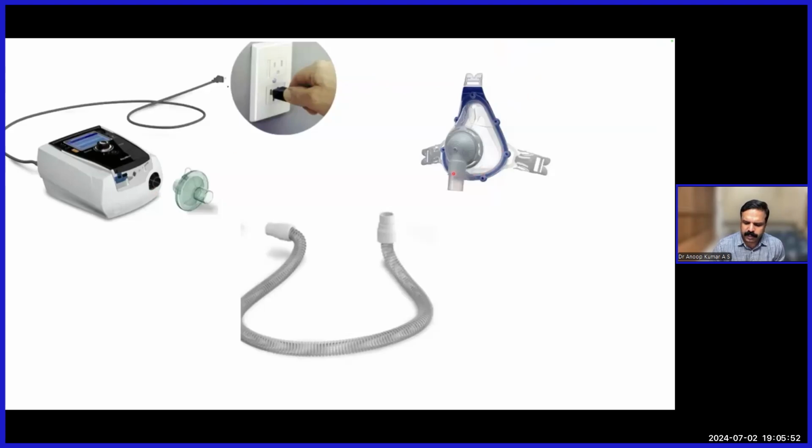So here again, we can modify the circuit, like during the COVID time and what you might have seen. Suppose you are using a non-vented mask, or ventilating using non-invasive ventilation for infected patients, or patients with an airborne infection like pulmonary tuberculosis, COVID, H1N1, influenza, etc. So here the exhaled gas will have viral particles, so that can infect the healthcare workers.